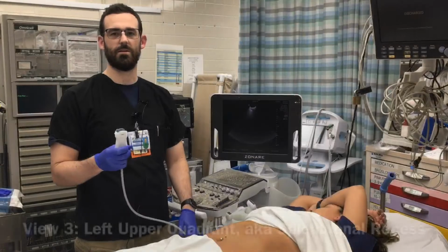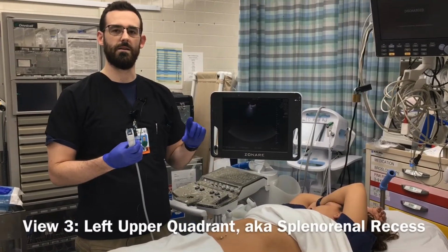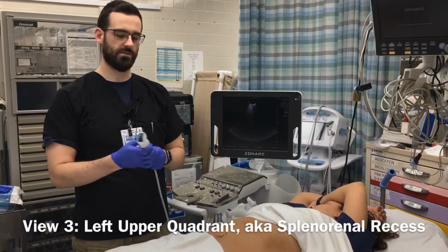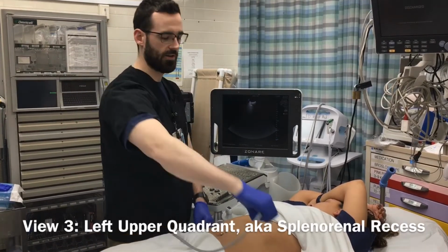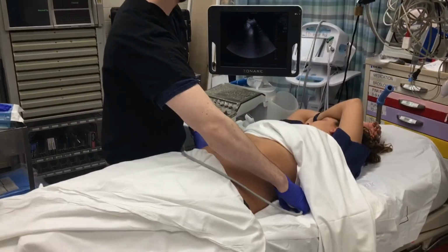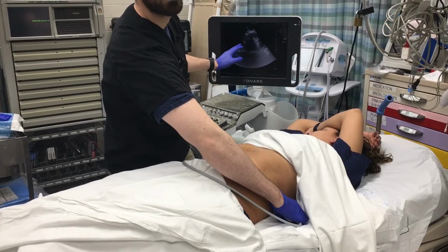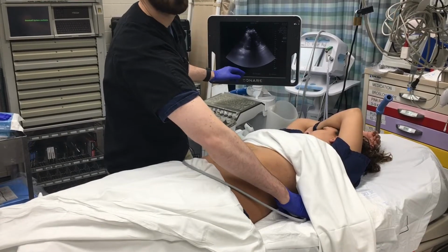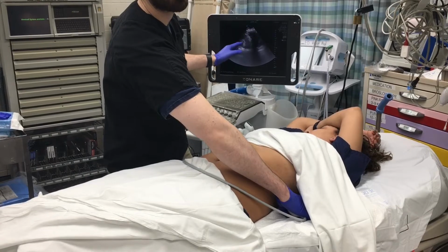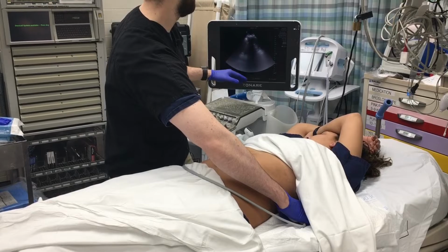The next spot you want to look at is the left upper quadrant, or the kidney and spleen interface. What you want to do is make sure your knuckles are down towards the bed, and you want to try to go as posterior as possible. And the most important areas to look at are where the spleen and the kidney come together, and also above the spleen, which the most sensitive area for that is actually the interface between the diaphragm and the spleen, and you want to scan through.